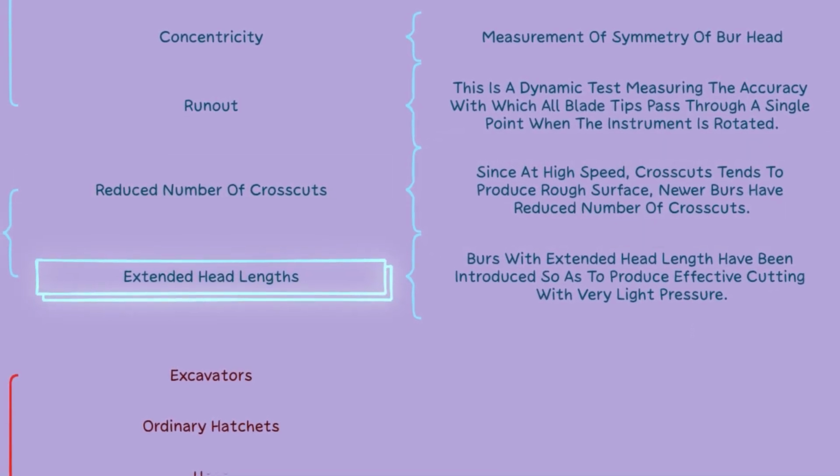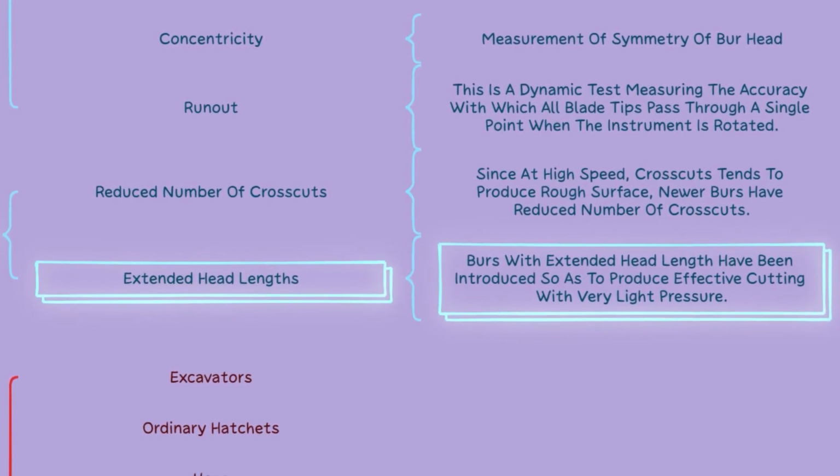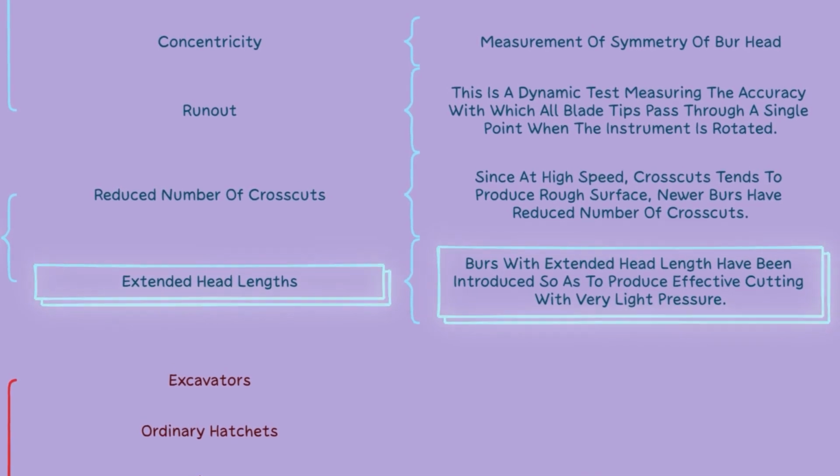Extended head lengths refer to the length of the head of a burr. Burrs with extended head lengths have a longer reach than burrs with shorter head lengths.